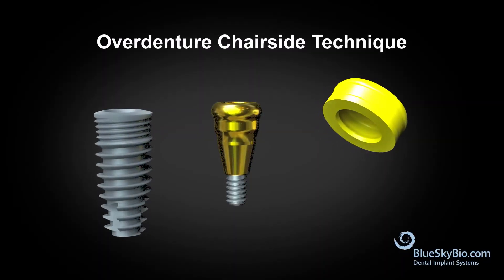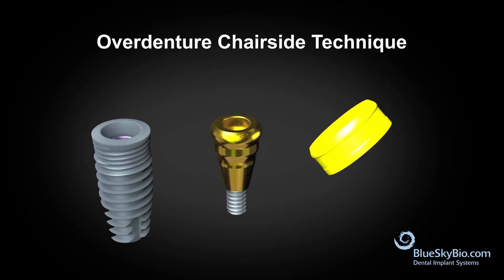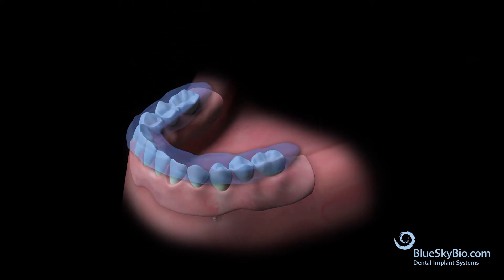This video shows how to perform an over denture chairside technique using the Blue Sky Bio implant system and the yellow super snap insert. Place the denture over top of the healing abutments and apply bite registration material over the denture.